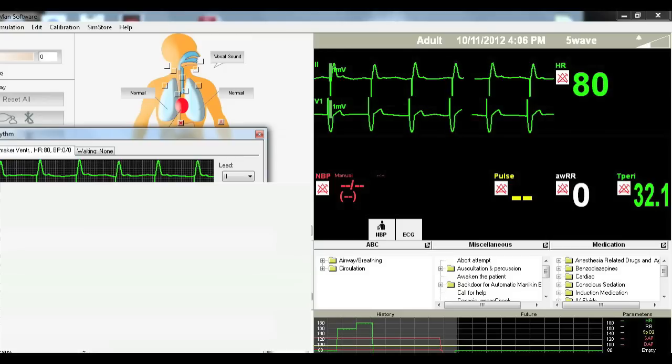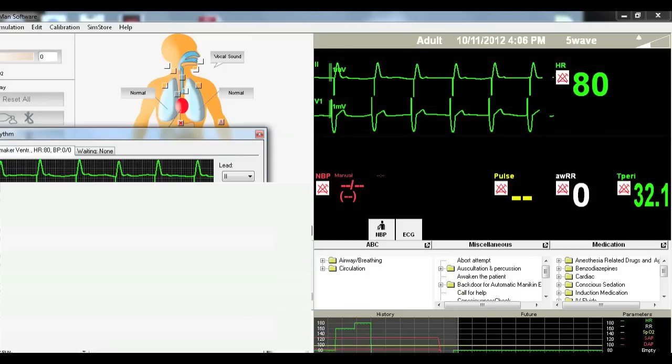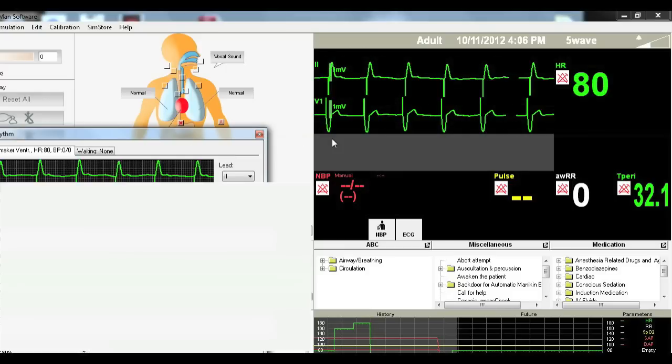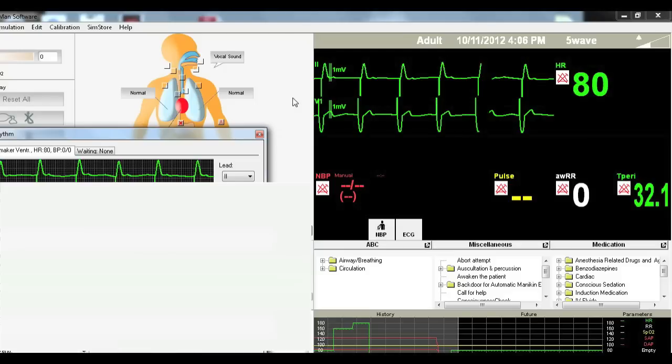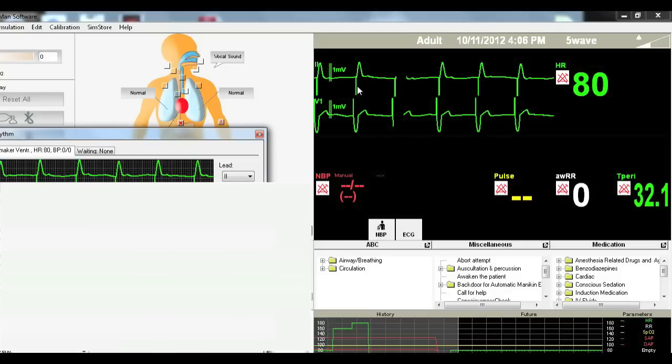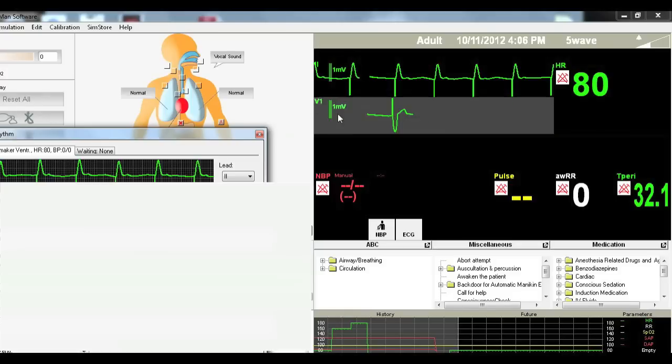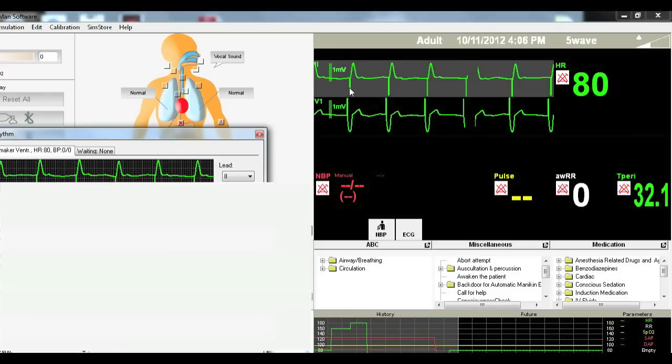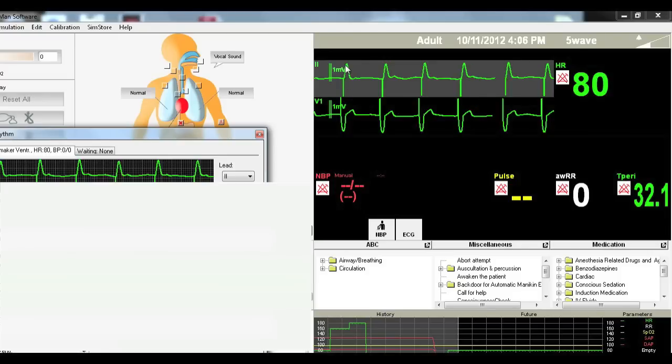So this is a pacemaker ventricular rhythm. Remember in the other video we talked about when you have a pacemaker, there is no cell in the human body that can conduct an electrical activity as fast as this straight line is. So you have to think that this is caused by some other foreign artificial stimulus. So this is a pacemaker. This is firing and it causes an artificial QRS to form.